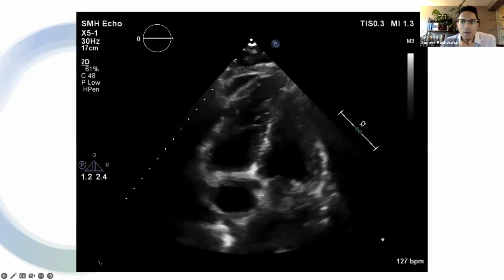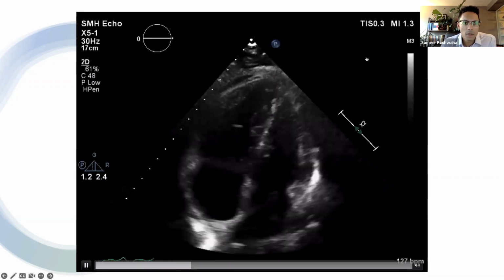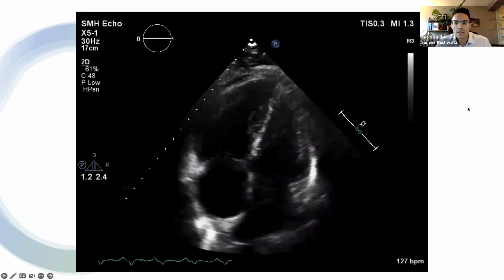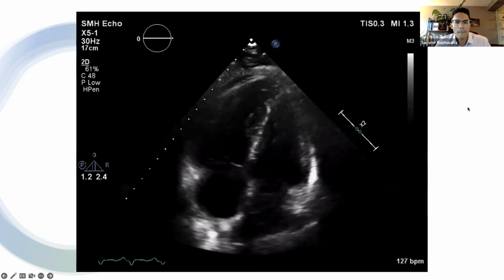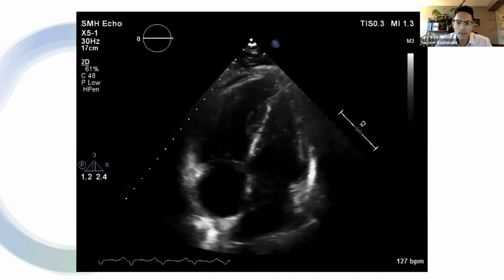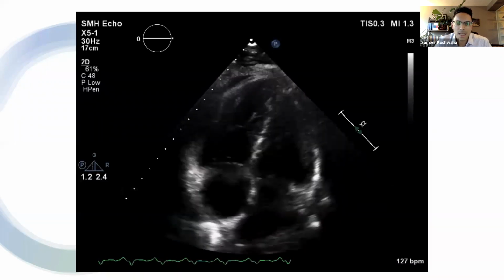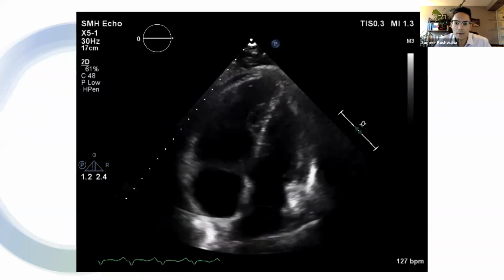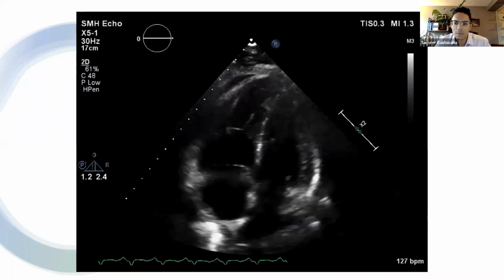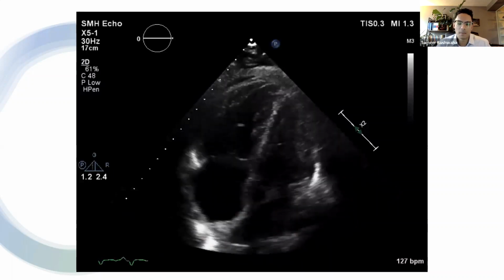And then moving on to the apical four-chamber, you can now see a small pericardial effusion located near the RV apex. You can see again that the RV is grossly enlarged and nearly the same diameter as the LV. The septal bowing is still visible. And if you really look at the right ventricular free wall myocardium, you can see that it is somewhat hypokinetic with impaired thickening, but the RV apex still continues to be quite mobile and contracts better than the rest of the RV, which is known as the McConnell sign.